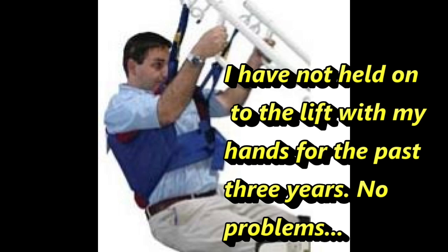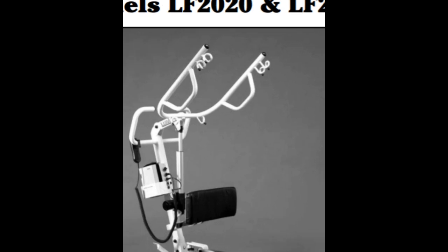Just as there are variations in our disease called inclusion body myositis, the sling loops used in your case may vary according to your height. Let's turn our attention back to the lift, and you'll notice 4 sling attaching points on the end of the lift arm. The outside set of loop hooks is designed for taller individuals, and the 2nd set of loop hooks can be used for shorter individuals being lifted.